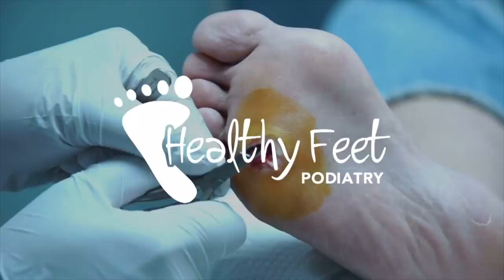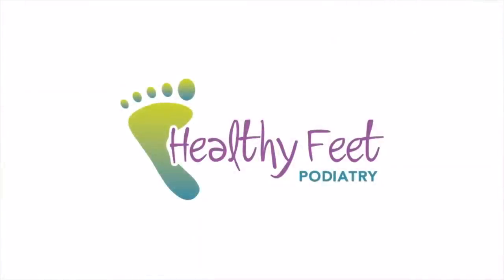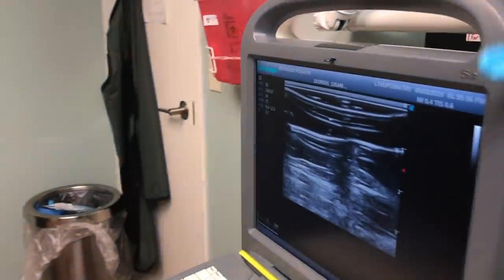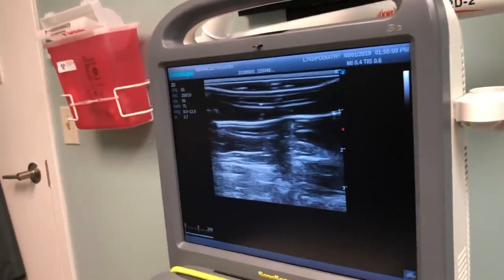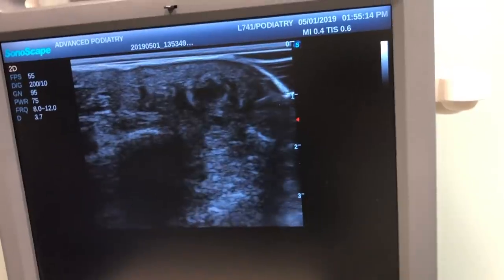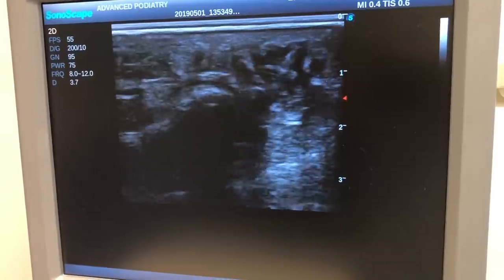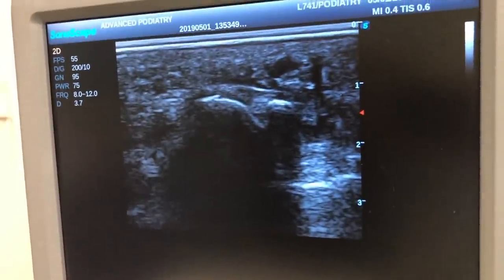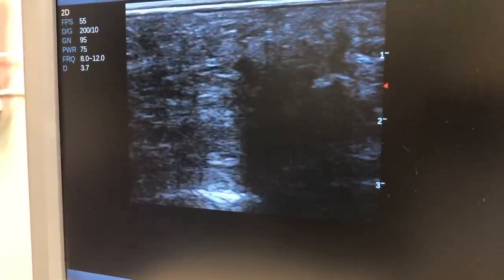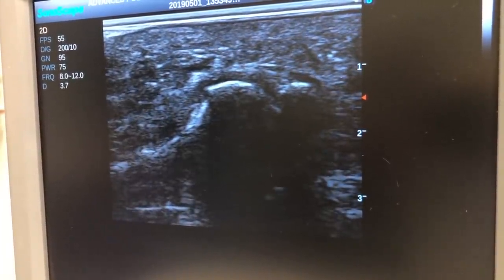I'm going to show you over here on the ultrasound to give you an idea of what it looks like. The first thing you're going to see — that little dome in the center is actually the metatarsal head. Then we're going to scoot over more and see the other metatarsal head. We know that the neuroma is between those two spots.